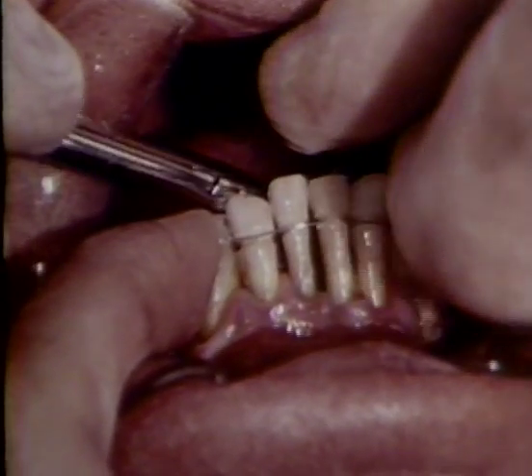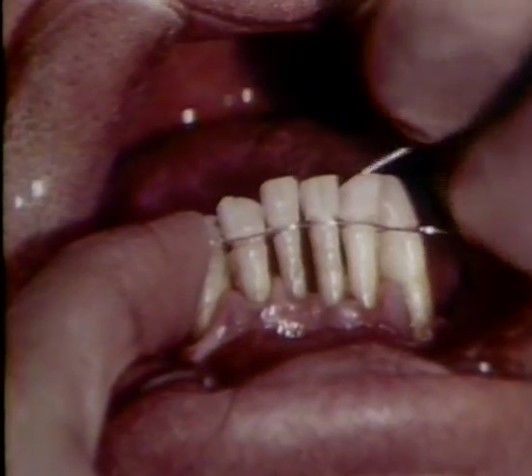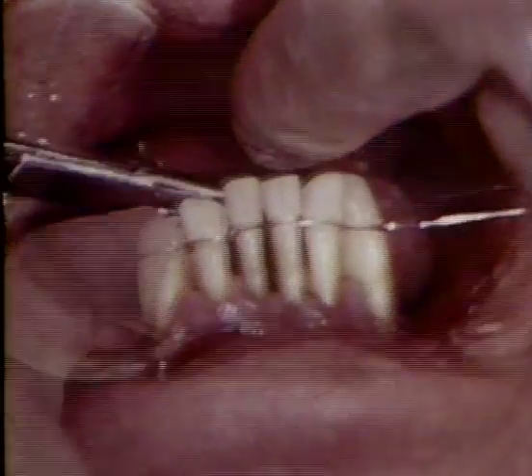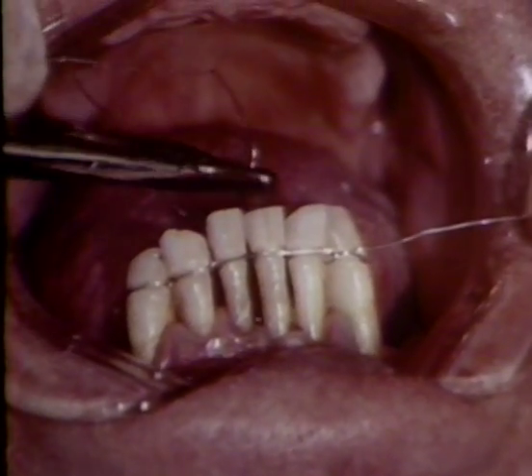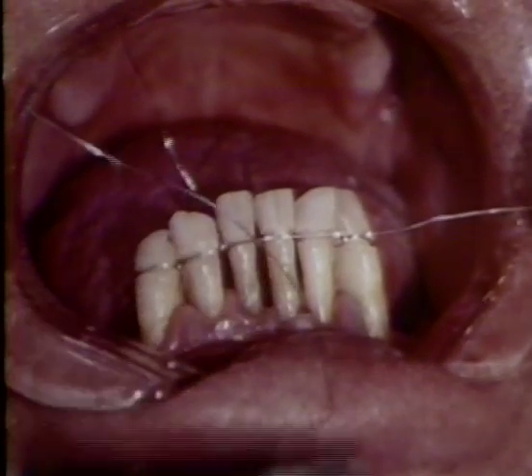It is now brought from the lingual aspect between the right central and lateral incisors back to the labial, again passing it under the master wire and carrying it over the master wire to the lingual side. The process is repeated with the other teeth until the end tooth is again reached.